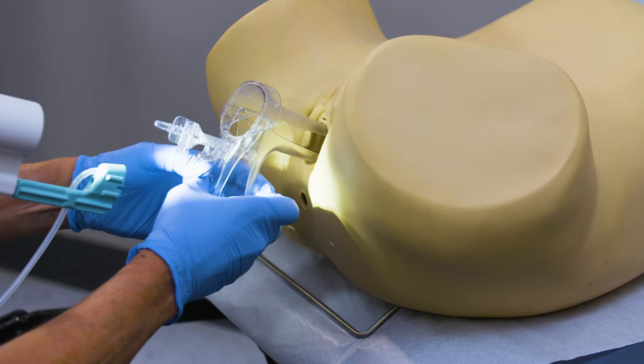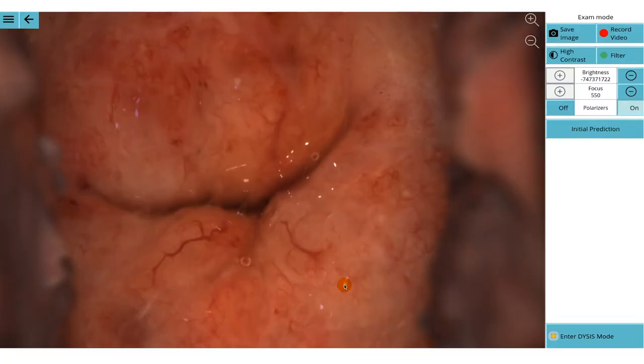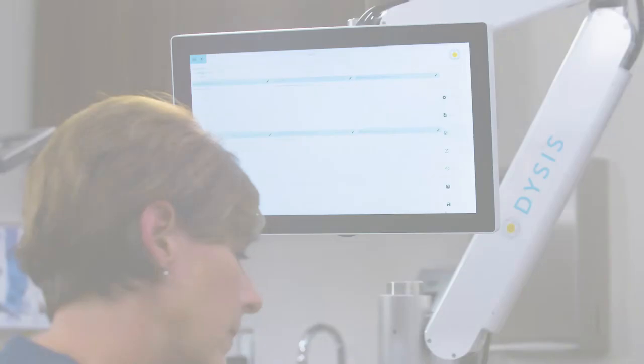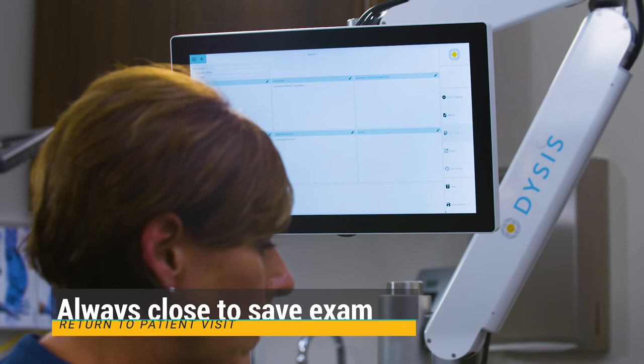Next, the provider will press Enter Dysys Mode, then Start Dysys Mapping to automatically apply the acetic acid and start the procedure from the touch screen interface. To close out the exam and return to Patient Visit Report, select Save and Close or select the back arrow key.